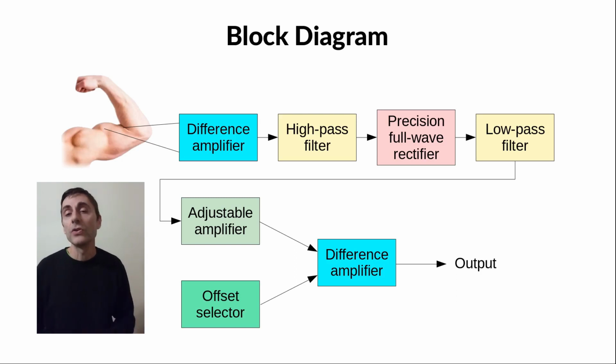locations. Then the signal goes through a high-pass filter in order to remove the DC component. We have to remove it because otherwise the signal would saturate when we amplify it further, and the circuit wouldn't be able to tell the difference between when the muscle is contracted and when it is not.